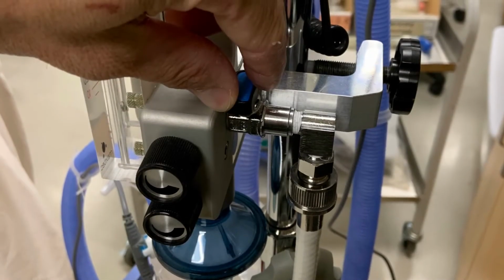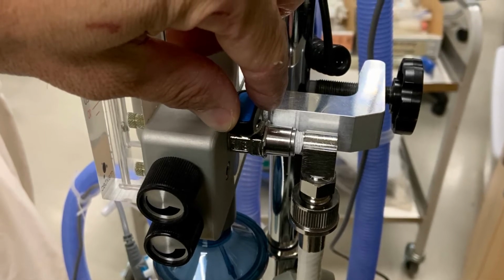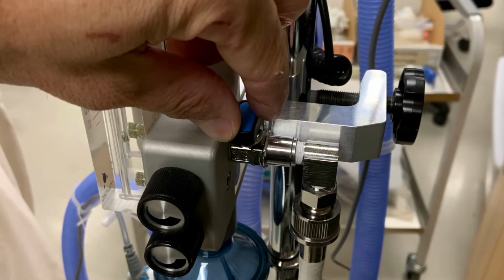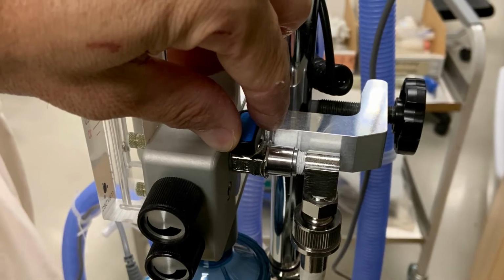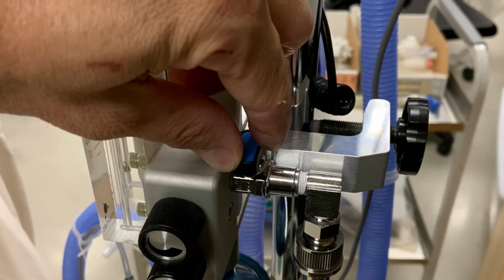When the shutoff valve is in line with the metal tube as it was in the previous picture, then gas is able to flow through this device. When the shutoff valve is 90 degrees to the metal tube as it is here, it will block gas flow.